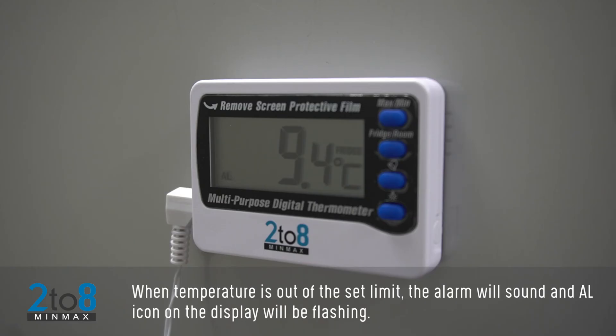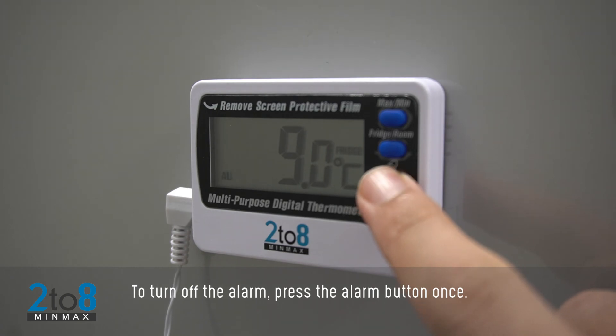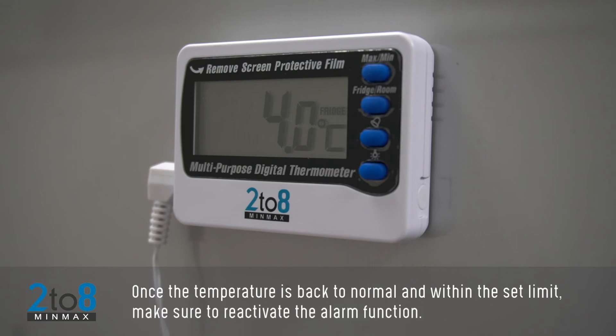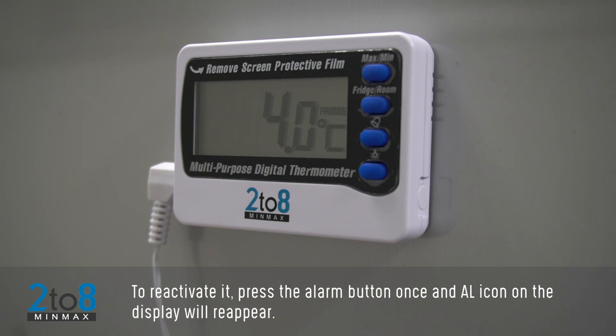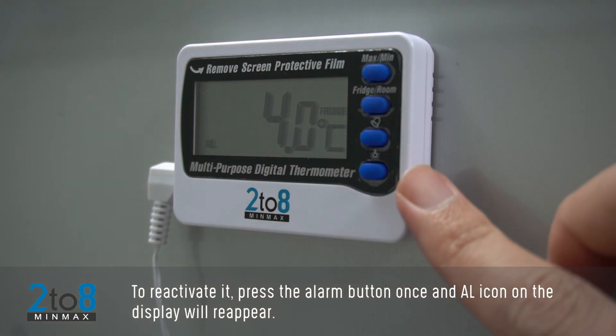When the temperature is out of the set limit, the alarm will sound and an AL icon on the display will be flashing. To turn off the alarm, press the Alarm button once. Once the temperature is back to normal and within the set limit, make sure to reactivate the alarm function. To reactivate it, press the Alarm button once and the AL icon on the display will reappear.